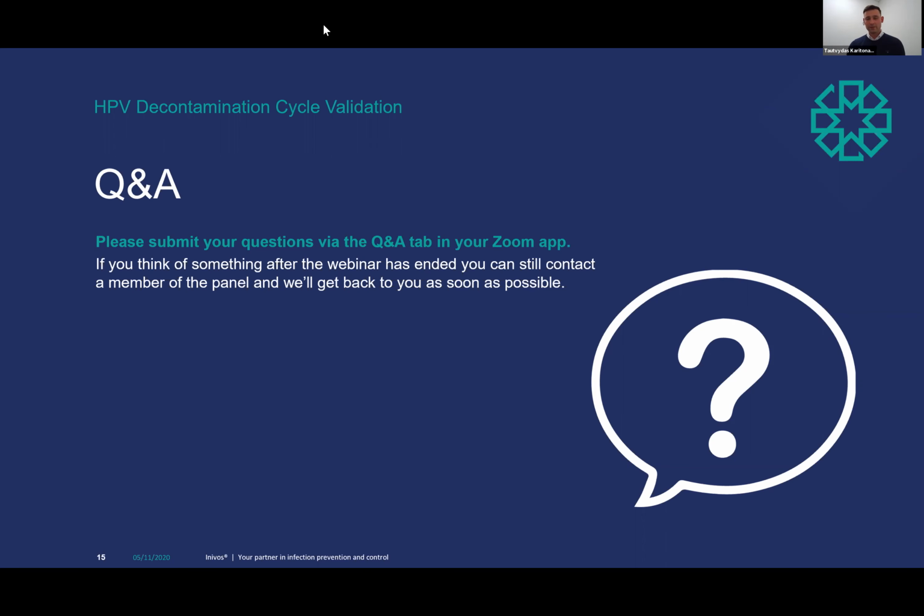So Kurt, final word from you. I suppose this is where I see all modern HPV systems going. I think electronic indicators are the way. It gives you the best chance of telling, given the limited information you've got, that the cycle was effective in the minimum timescale. You get almost the same indication surety level that you might have with a biological indicator, but you get it immediately. And I think that's surely where the industry is going.